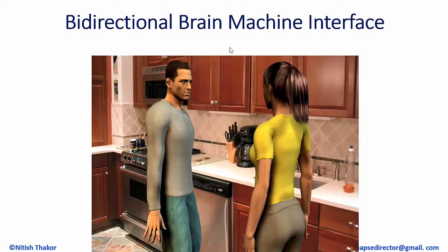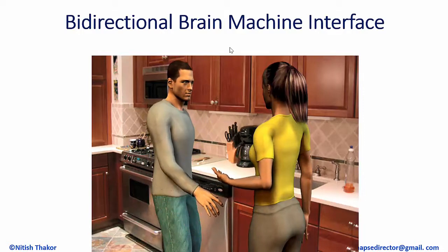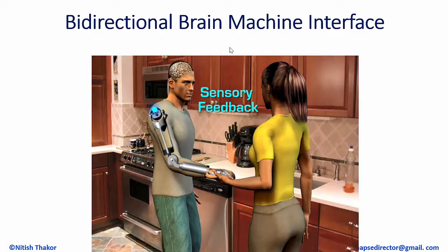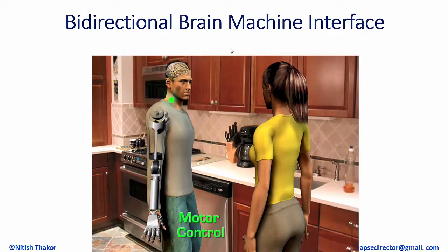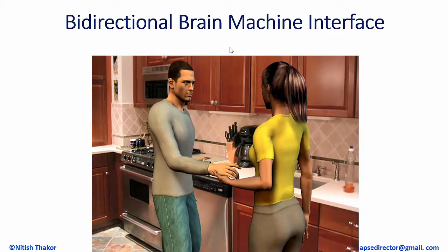Okay, so that's for the movement, which means our brain controls the machine, right? The signal comes from the brain, through the spinal cord, to the nerves, to the arm. But what about the reverse? Can we carry the sensations back? That sensory feedback, the sense of touch, is the main focus of my presentation today. How can we pick up a sense of touch, when you shake hands, and carry that feeling back to a person? After about a decade of work on prosthesis and control, in the last few years, this has been a major focus around the world, and my research is tied to this area.